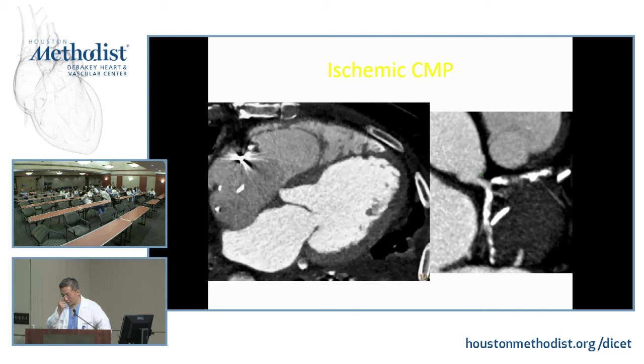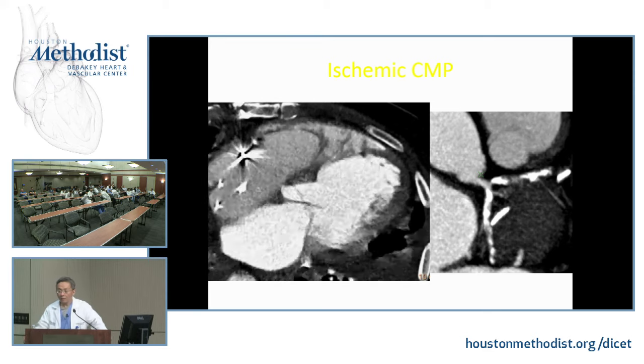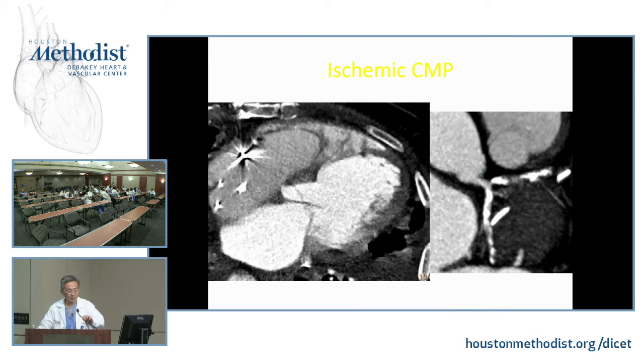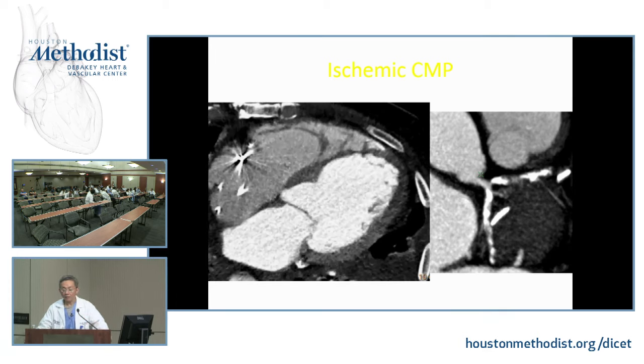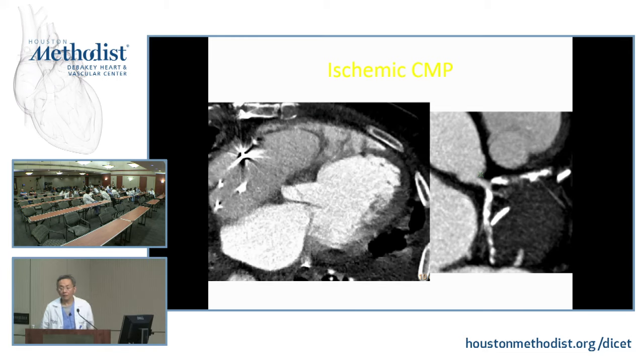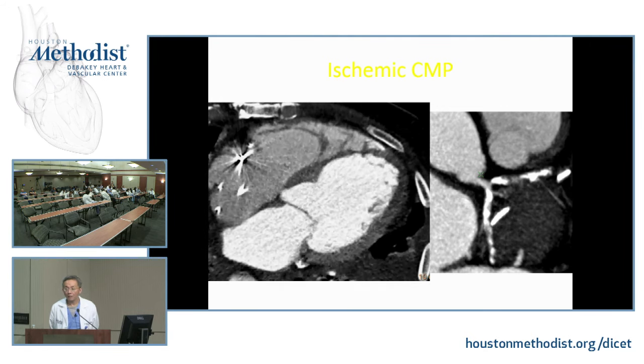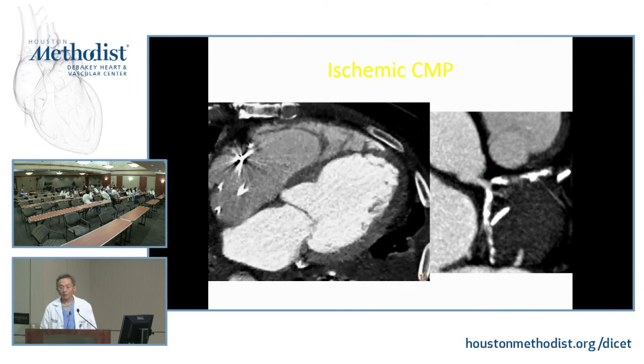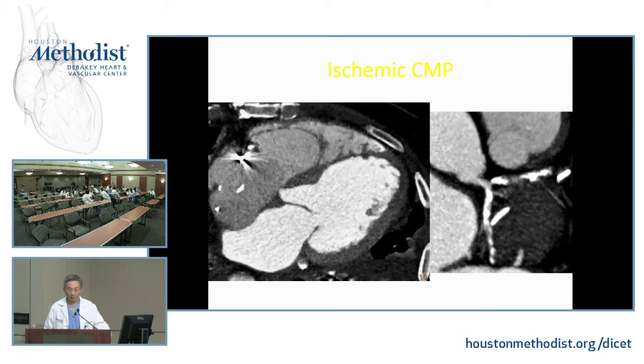CT-FFR is not a 100% test. So when you have a calcium score in the 1500 or 1000, yes, you can spend a long time and potentially say, okay, I cleared every segment, or there is that diagonal that I cannot clear. But I still feel it's not the ideal test when you have other good perfusion studies, whether you want to do it with CT, with MRI, or with nuclear imaging, specifically PET, in these patients. I feel it does add incremental value.